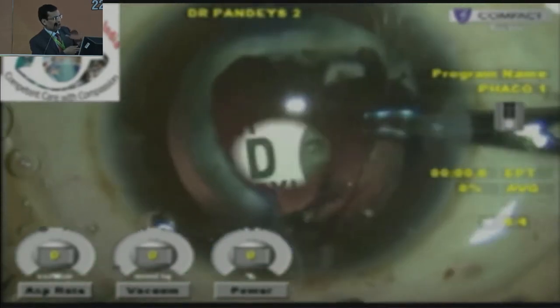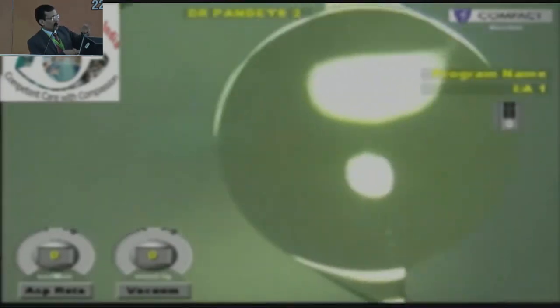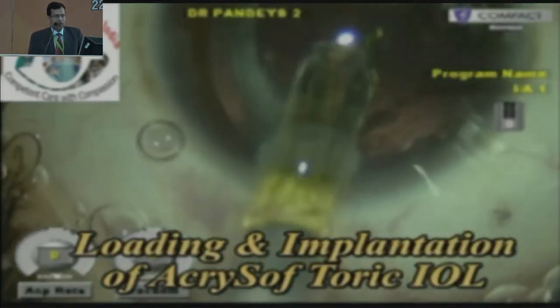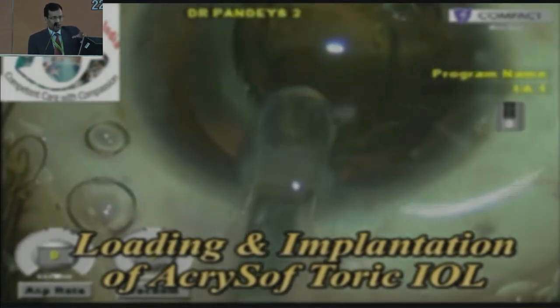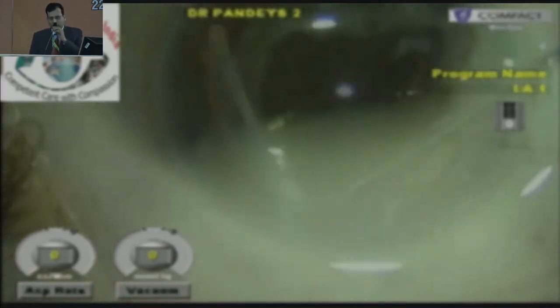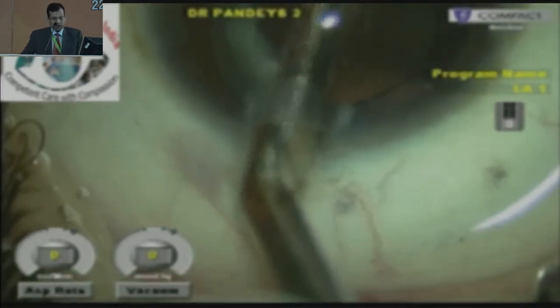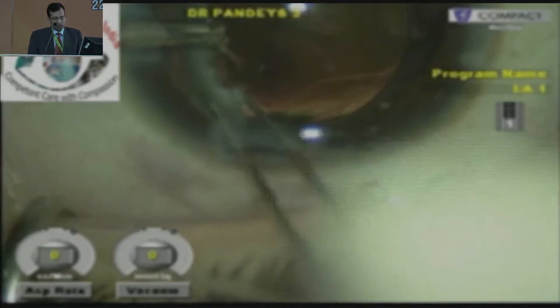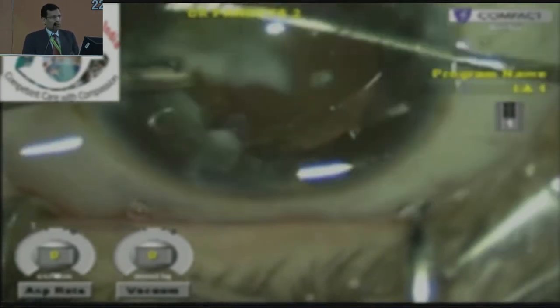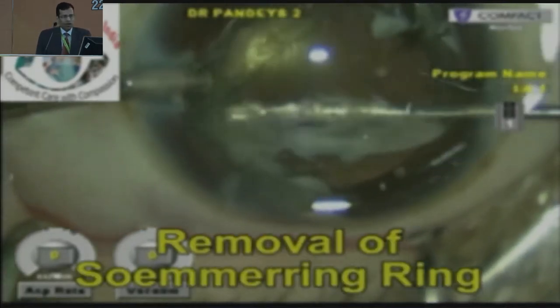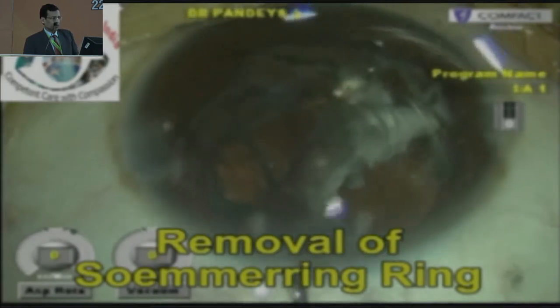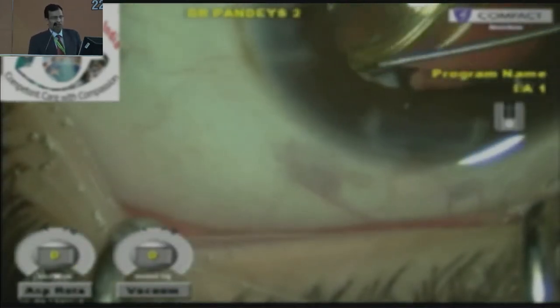Since the capsule was fibrotic due to long-standing trauma, there was less chance of runaway capsulorrhexis. I made the opening, implanted the lens, then dialed the lens clockwise and anti-clockwise in order to loosen the Soemmering's ring. Once the lens was implanted in the bag, I used viscodissection technique to remove the Soemmering's ring, as you can see here. The Soemmering's ring can be removed through irrigation-aspiration or viscoexpression — inject viscoelastic and apply gentle pressure on the posterior lip of the incision, and the Soemmering's ring comes out.